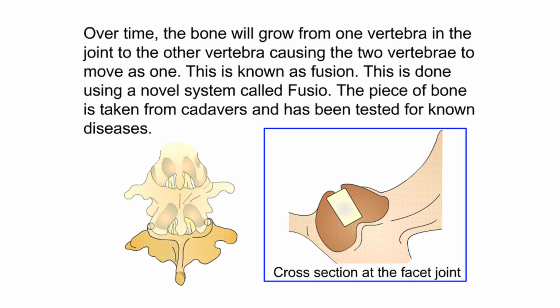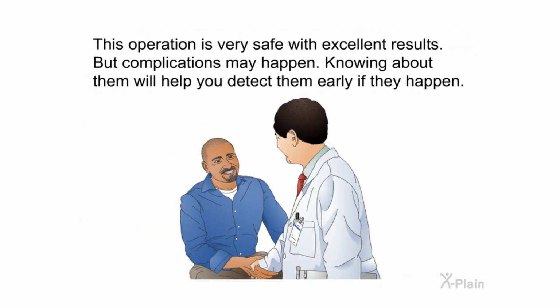The piece of bone is taken from cadavers and has been tested for known diseases. This operation is very safe with excellent results, but complications may happen. Knowing about them will help you detect them early if they happen.